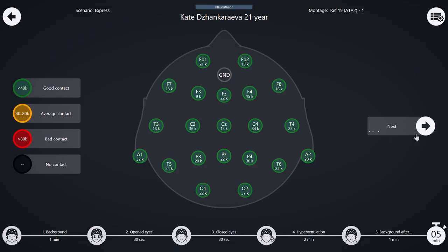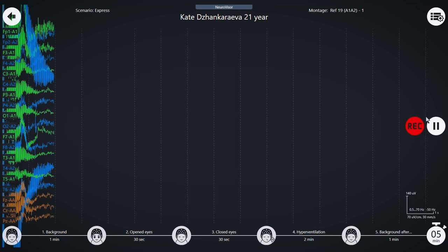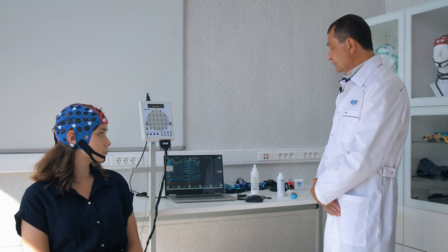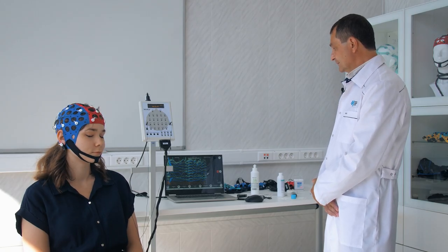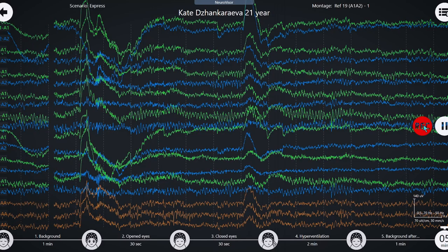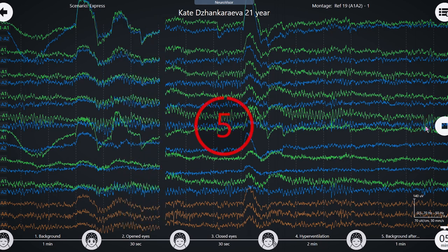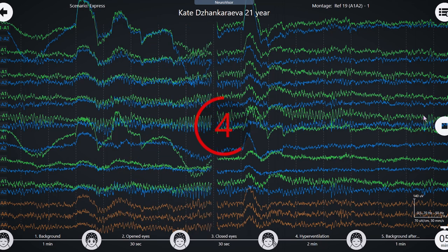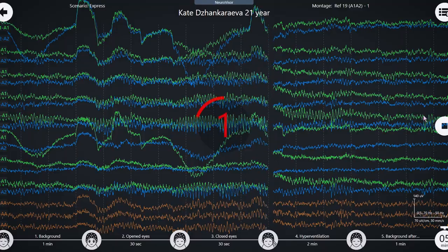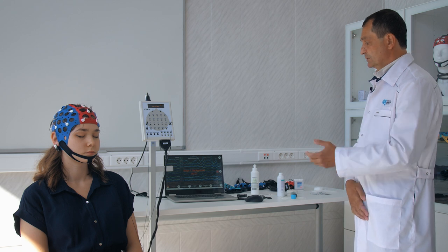We have successfully achieved an acceptable impedance and initiated data acquisition. Please remain still, keeping your eyes closed. Once we have verified that the data capture process is proceeding smoothly, we press the record button to initiate the recording. The data being captured is already being written to a file, physically stored on the disk drive.